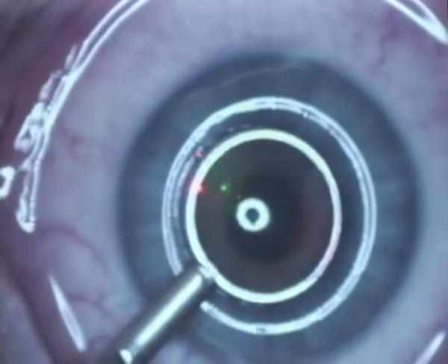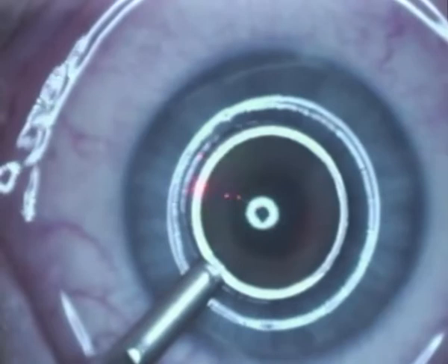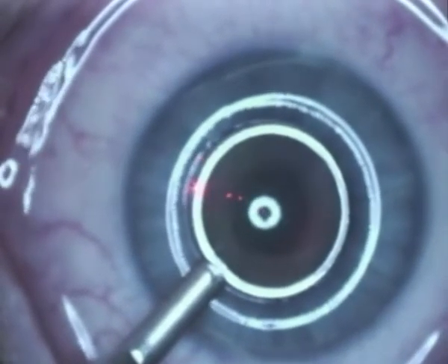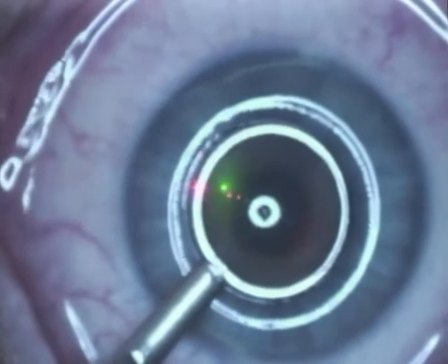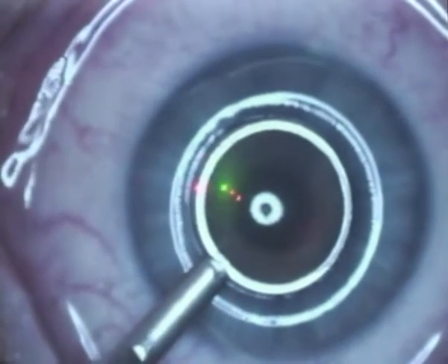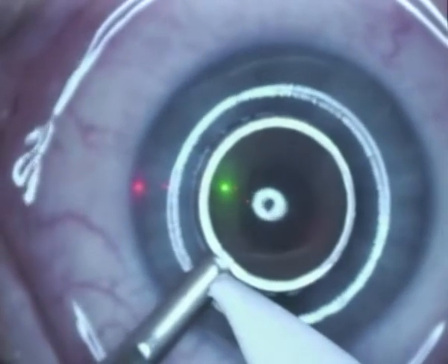We then instill some alcohol — this is 20% ethanol solution — which is kept in the well for a period of about 40 seconds. If the epithelium separation on the first eye proves to be difficult, then we leave the alcohol in for longer for the second eye.